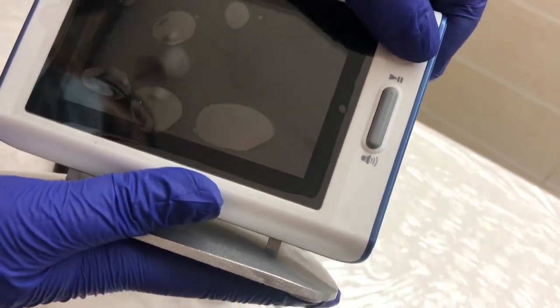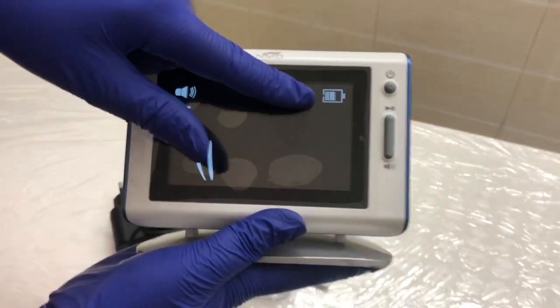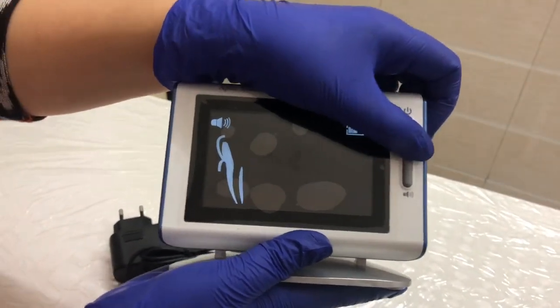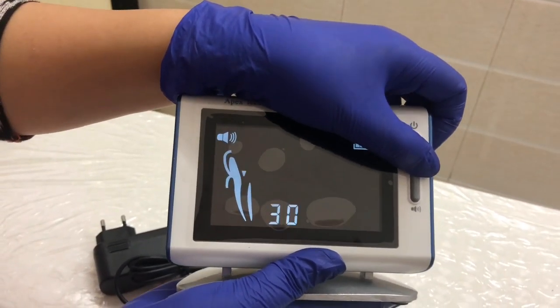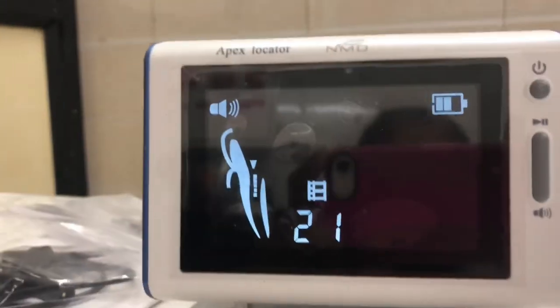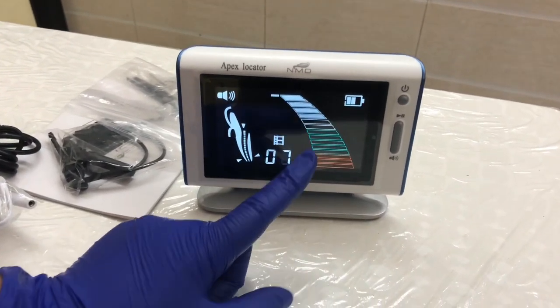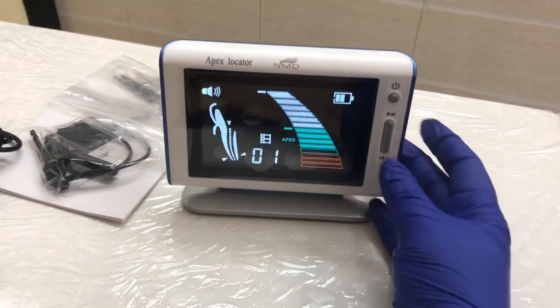Let me just press this power button. You can see here this indicates your power indicator, this is your sound indicator, and this is your file movement display. Let me press the display button to show you how it works. This is the enlarging display of root zones, and you can even adjust the sound.